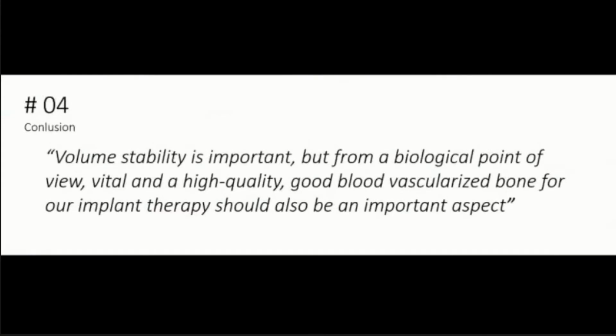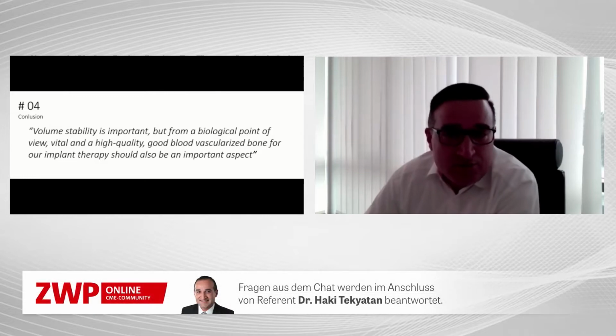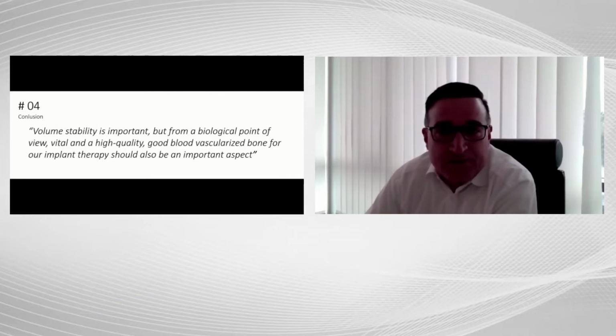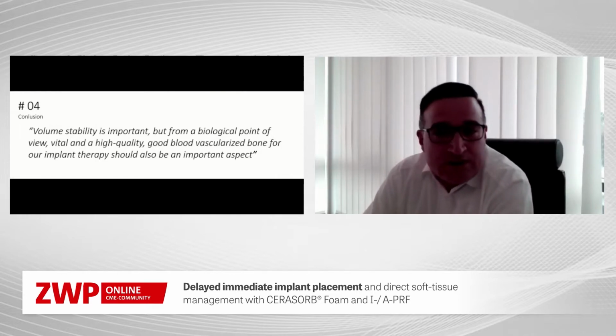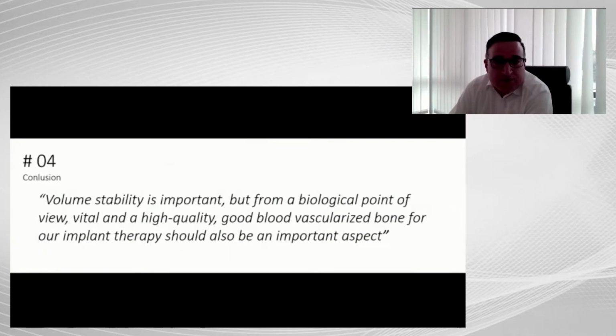When we come to the conclusion, of course, dear ladies and gentlemen, volume stability is important. But from a biological point of view, vital, high quality, well vascularized bone for implant therapy should also be an important aspect. We know from the literature that total volume stability is not possible. We always have more or less resorption. In this context, we maybe have to rethink everything. This is not only my opinion.